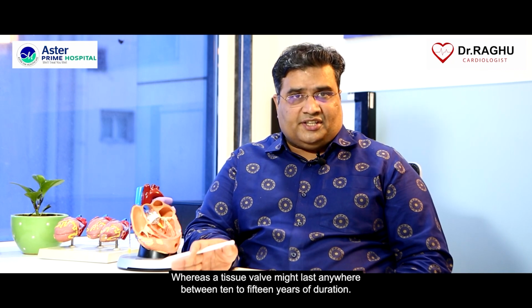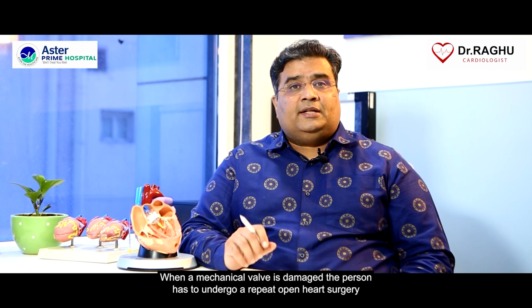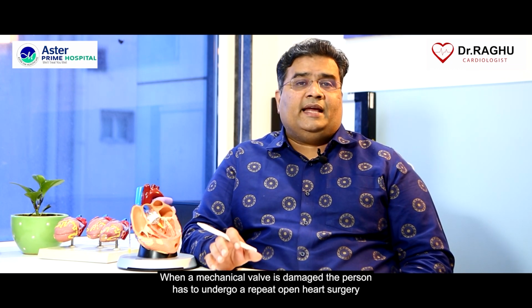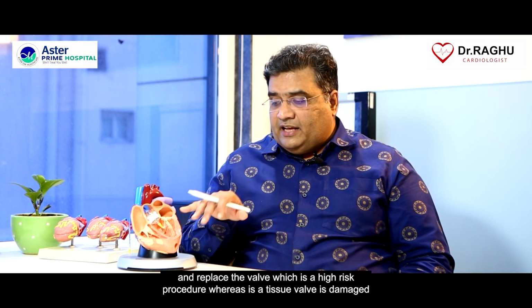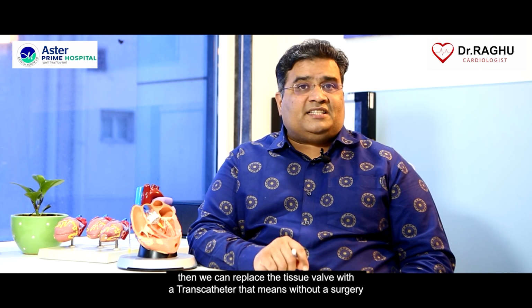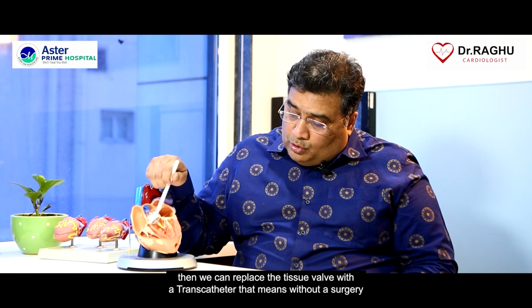When a mechanical valve is damaged, the person has to undergo a repeat open heart surgery to replace the valve, which is a high risk procedure. Whereas if a tissue valve is damaged, we can replace it with a transcatheter, that means without surgery, going through the groin.